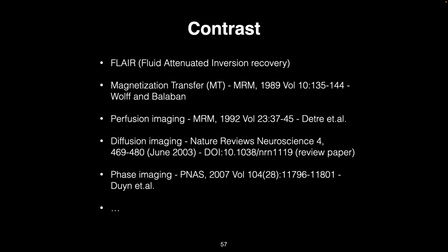So you can sensitize those magnetic moments in your water molecules to entirely different environments and effects. This is just a sampling of some of the major imaging techniques that have developed over the years, but it is by no means exhaustive.